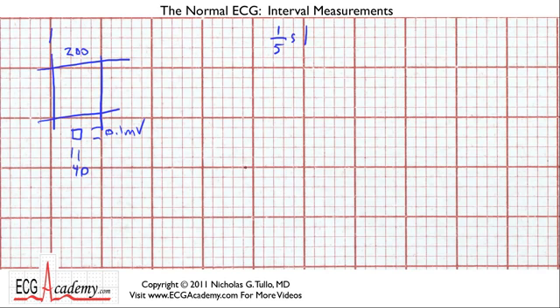If you recall, the atrial depolarization gives you a small bump known as a P wave. Ventricular depolarization results in a QRS complex. And then there's always a relaxation wave known as the T wave. So that's the QRS, and here's the T wave.